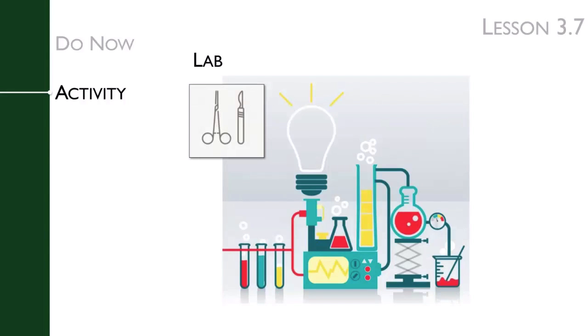This lab entails students testing several fake blood glucose samples, which are simply glucose dissolved in water. If you are going to complete this lab as written, you will need to prepare 5 solutions of varying concentrations of glucose before class. Caution, it can take some practice to get these glucose solutions to yield the same colors on the glucose testing strip as we show in the slide, so be sure to give yourself adequate time to prepare for the lab. Alternatively, you can make up your own solution concentrations and adjust the scale you give your students accordingly.